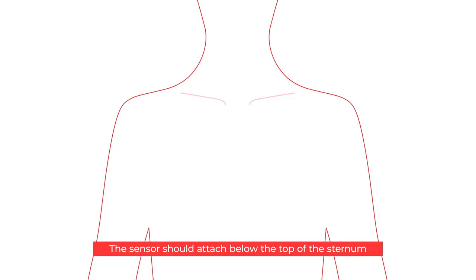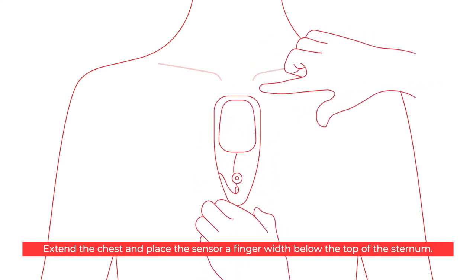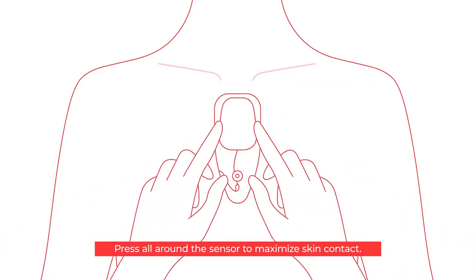The sensor should attach below the top of the sternum. Extend the chest and place the sensor a finger width below the top of the sternum. Press all around the sensor to maximise skin contact.